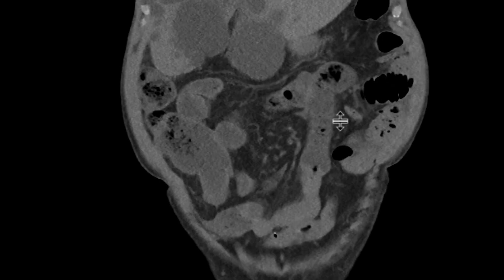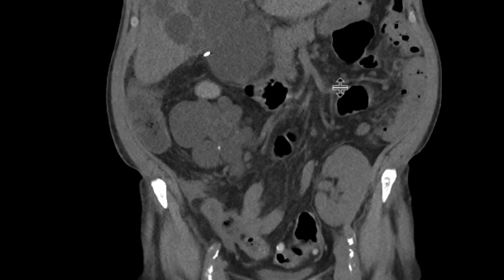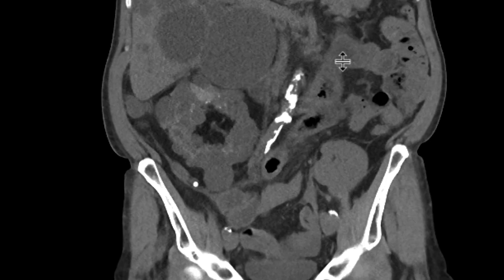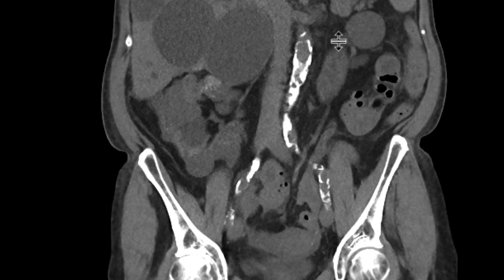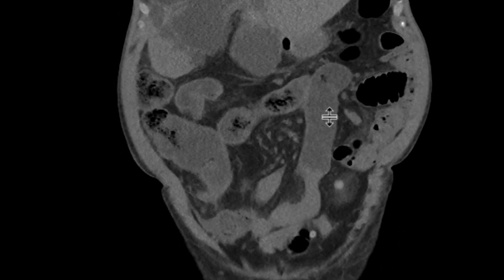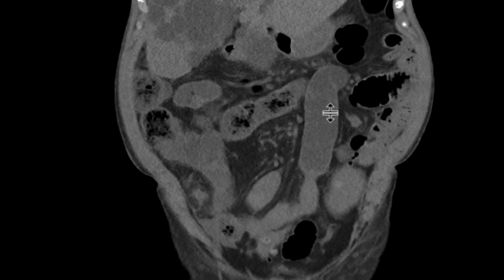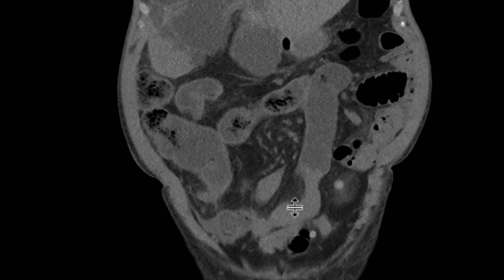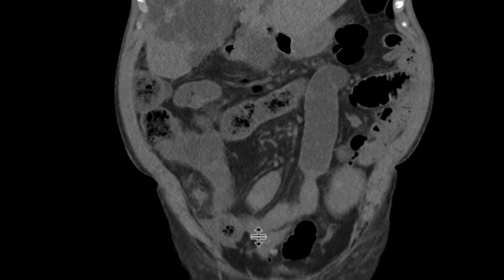We look at this on the coronal CT. I think we can see some of the findings a little bit easier, certainly the liver cysts and renal cysts. If we scroll down and focus on the cecum, this is the terminal ileum coming in over here. And this is the base of the appendix. It looks a little bit thick-walled, and there's some inflammatory change around it.